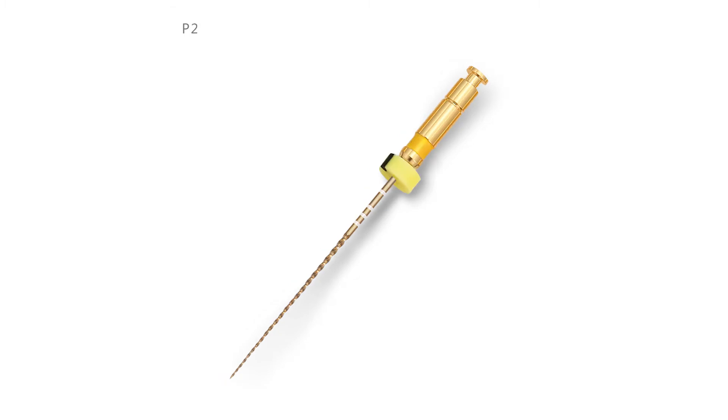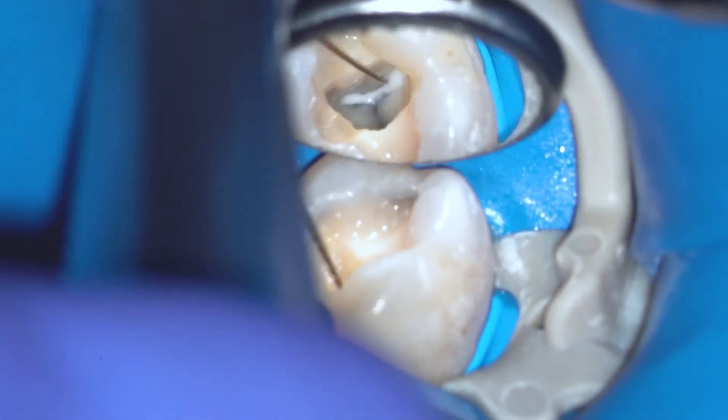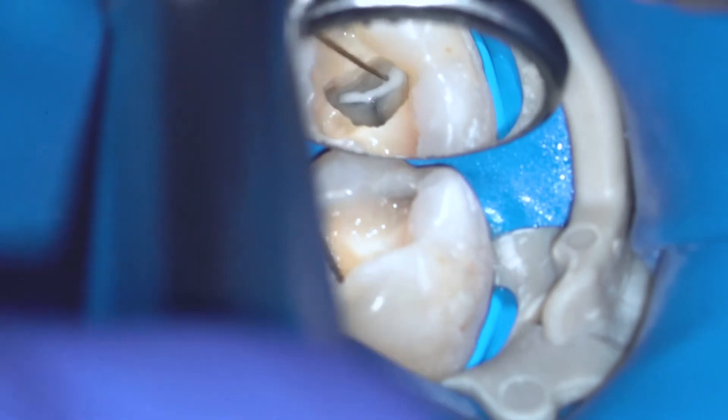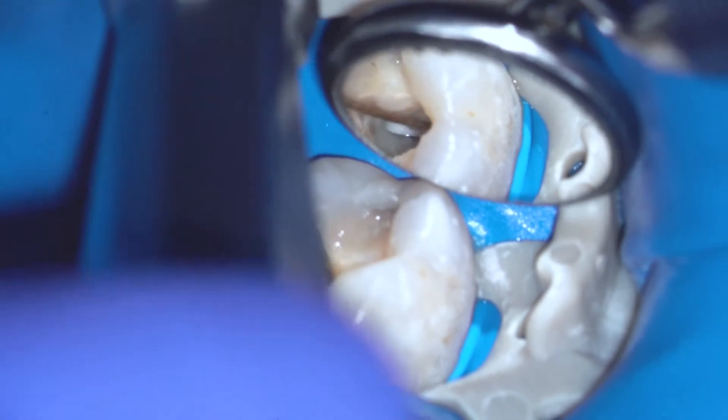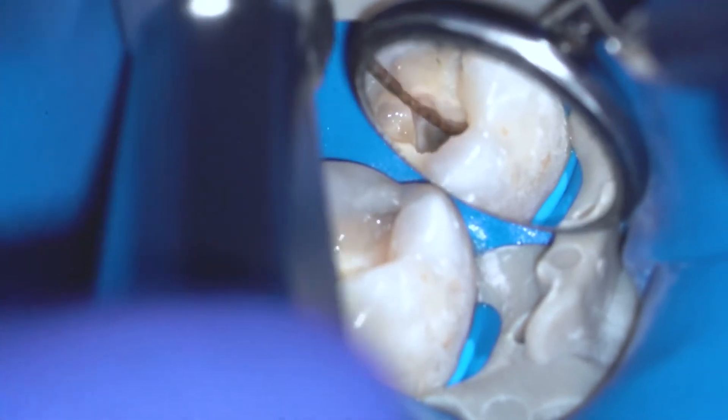And you can start the rotary glide path with two files from the MG3 set. Now you are ready for the shaping protocol. For the shaping protocol you have three files: 2004, 2506, and 3504.